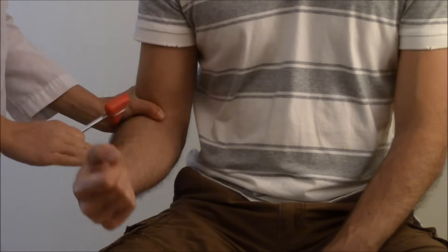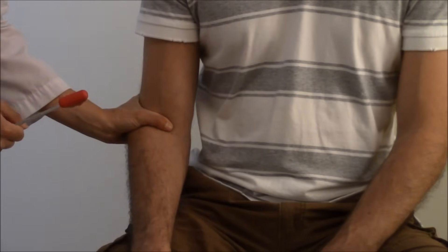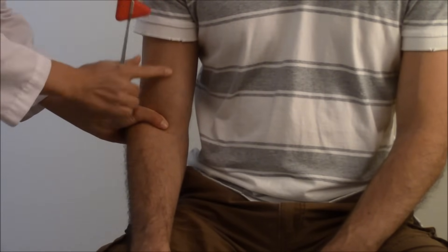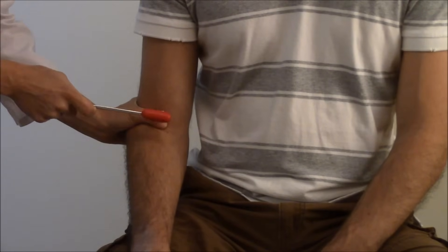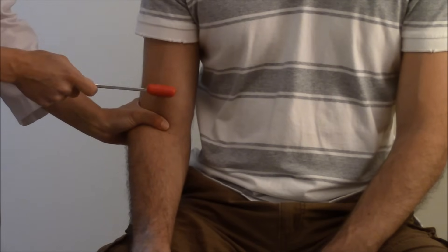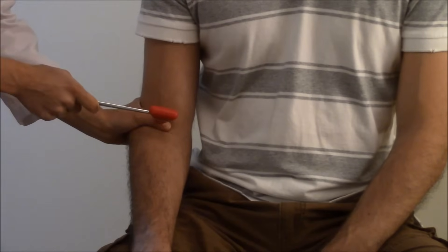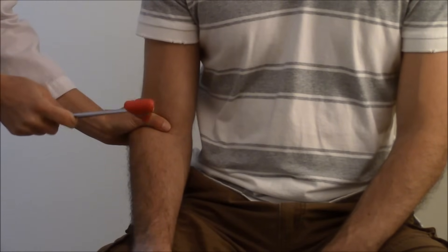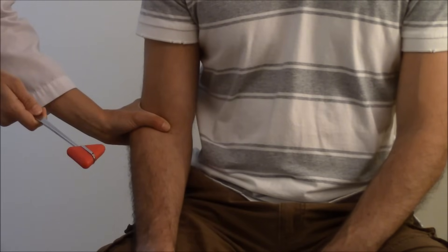This is going to elicit a response of C5 to C6. With your thumb over the tendon area, have the patient relax the muscle and drape his forearm over his lap. Then hit with your hammer briskly — what you're looking for is contraction of the bicep and flexion of the forearm.